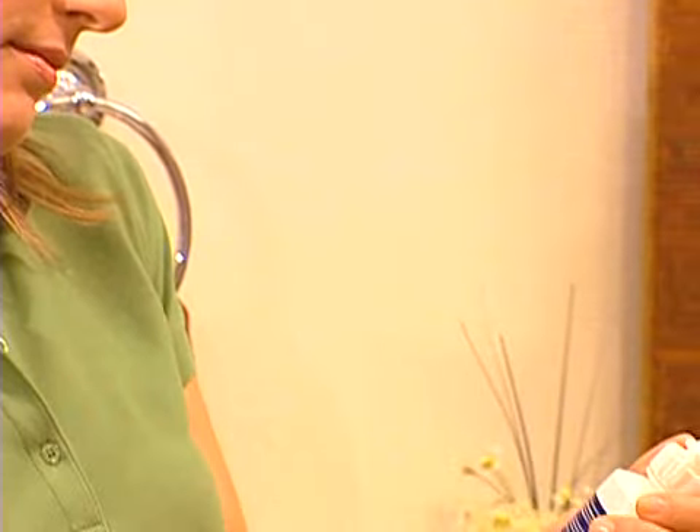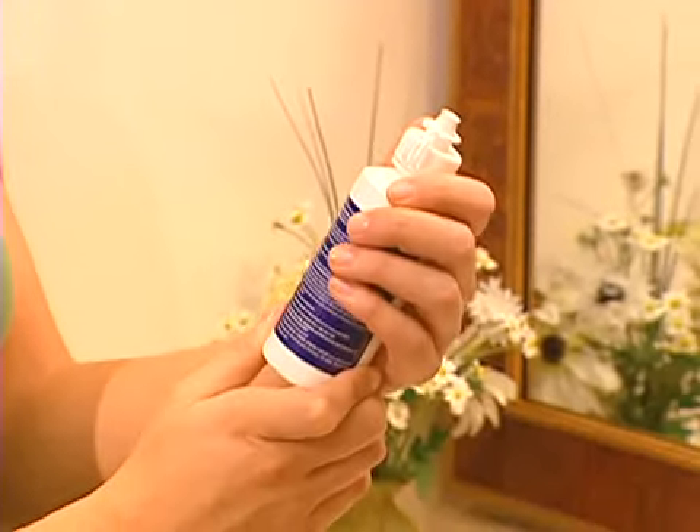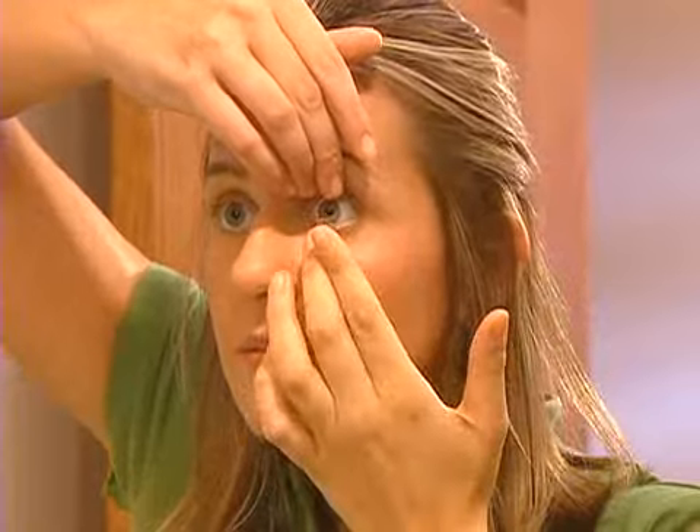Every care system has different instructions, so be sure to carefully follow the directions provided by your contact lens professional, because some solutions require a separate rinse in the morning while others allow the lens to simply be applied to the eye.